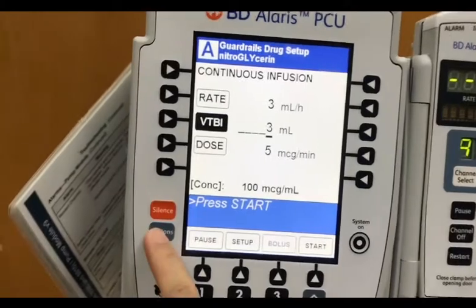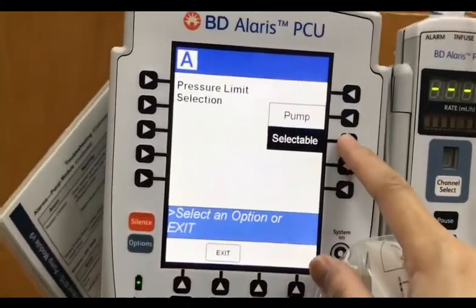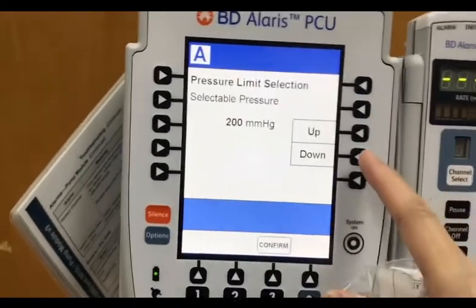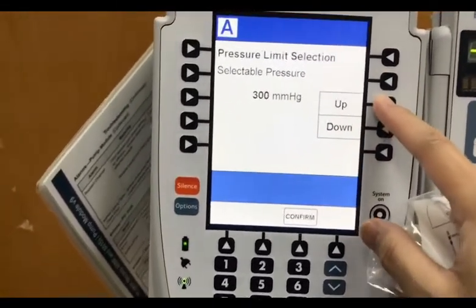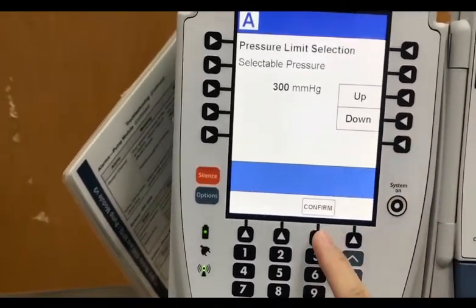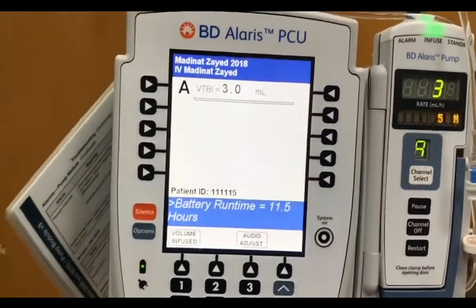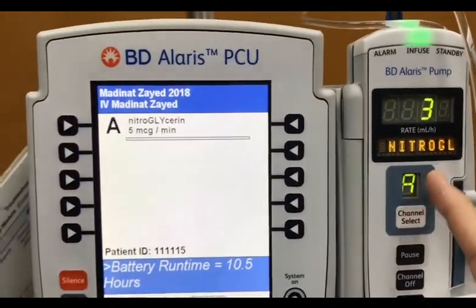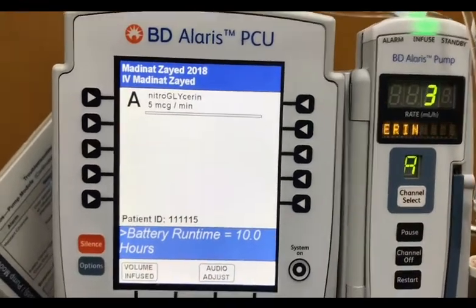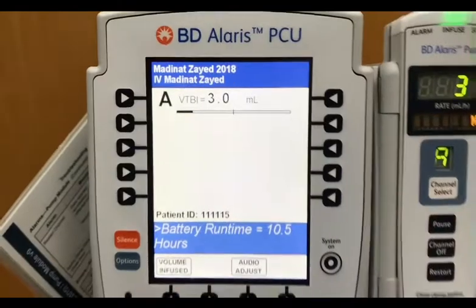So again, let's see the pressure limit for adult. Make sure that it is like 250 or 300 so that it will not alarm. Just say, let's say 300. Confirm, and then you can now start the infusion. So it is now infusing 5 mcg/min of nitroglycerin. So that's it.